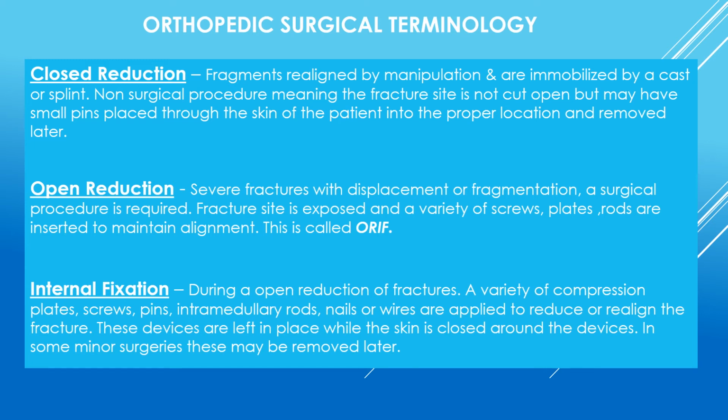Open reduction. Severe fractures with displacement or fragmentation. A surgical procedure is required. The fracture site is exposed, and a variety of screws, plates, and rods are inserted to maintain alignment. This is called an ORIF.